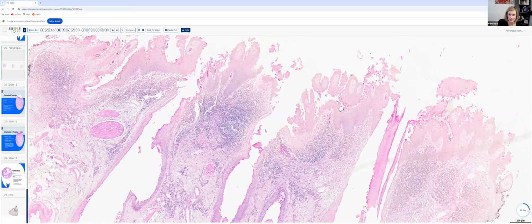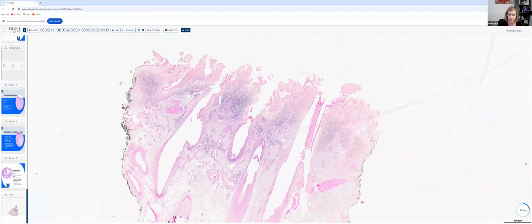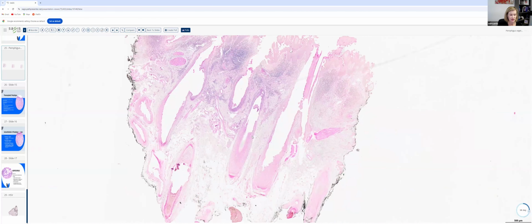And in some of these cases, if we do see just this very verrucous appearance and kind of a pseudoepitheliomatous picture, we would want to perform stains for not only PAS, but also AFB, to rule out a deep fungal or mycobacterial infection.